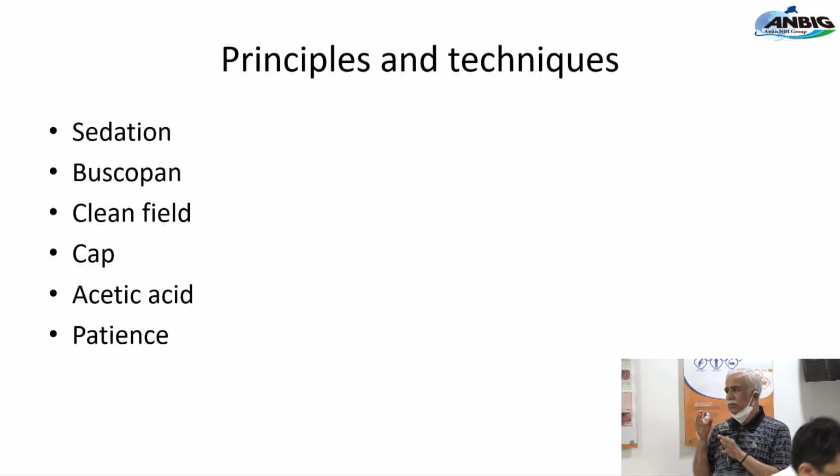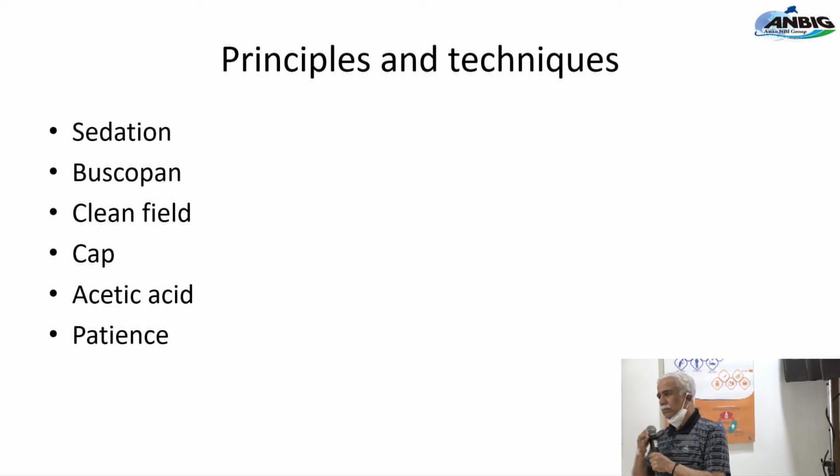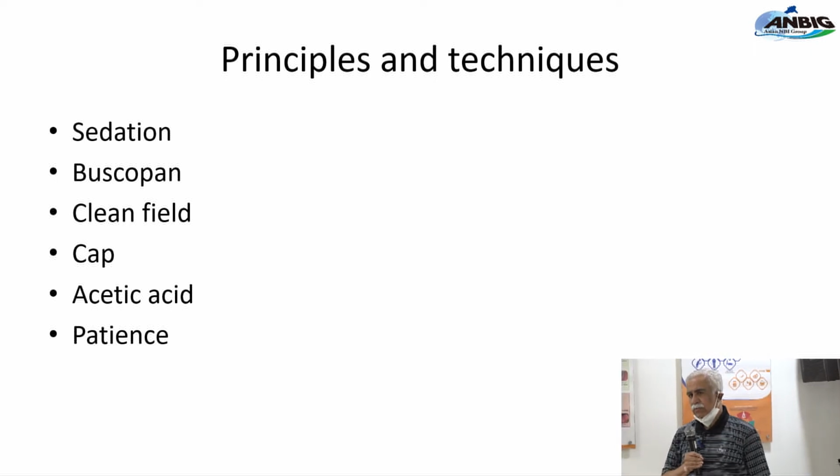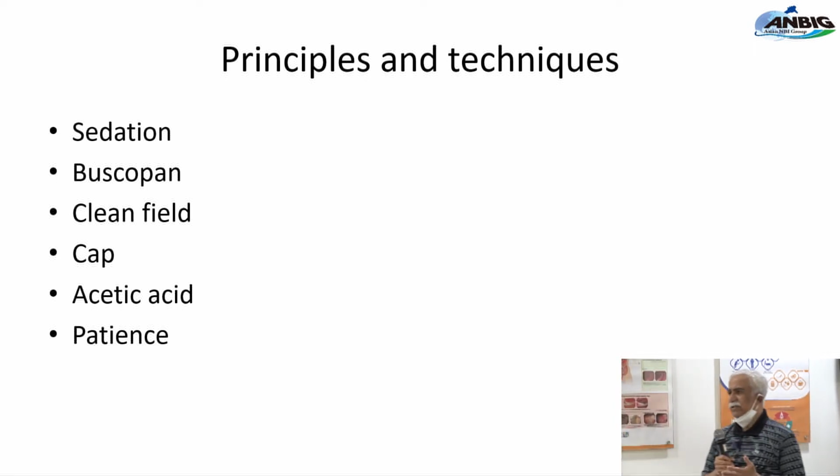How much time do you think we need to give for a good upper GI endoscopy? 8 to 10 minutes. Okay, how much do you give yourself? I just do diagnostics, I think 6 minutes. 6, okay. All right. So the figure that's quoted is about 7 minutes. So you don't need 10 minutes, and believe me, it actually doesn't take 10 minutes. It doesn't even take 7 minutes unless you are interrogating something.